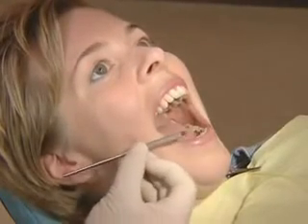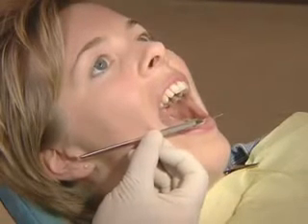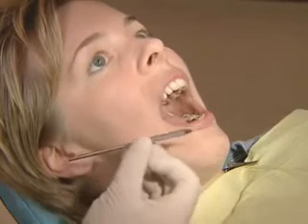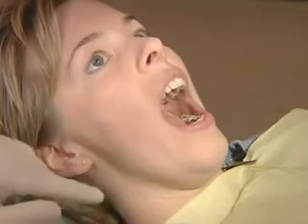The patient should open her mouth wide, and you're lining up the plane from the corner of the mouth to the intertragic notch, which is that part of the ear just below the tragus. This gives the correct angle that the syringe will take when going intraorally. It is also helpful to look at the angle that the tragus makes with the face, as that will also help with the orientation of the syringe intraorally. Once the angle is determined, you're then able to begin the injection by palpating your intraoral landmarks.